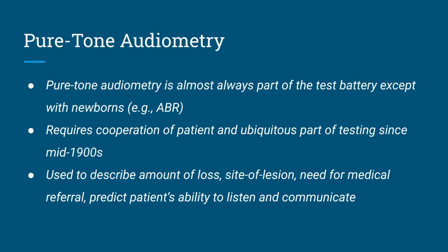We do have tests that are able to measure more complex auditory processing, but pure tone audiometry is not one of those tests. So pure tone audiometry is almost always part of the test battery, except with newborns. With newborns, you may be conducting an ABR, an auditory brainstem response, a diagnostic auditory brainstem response test in place of pure tone audiometry if you're trying to find frequency-specific thresholds for a newborn or an infant that's under 6 months old.